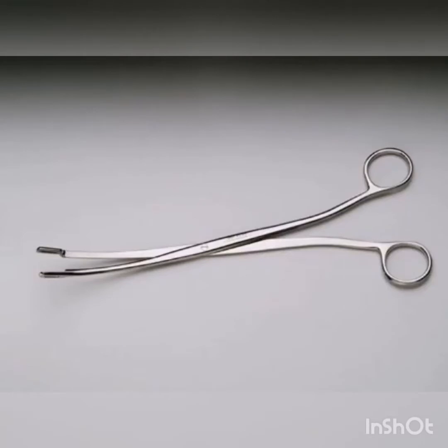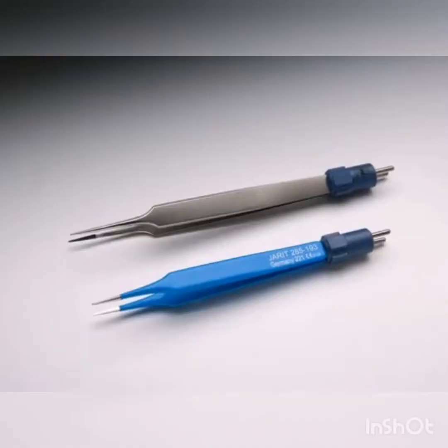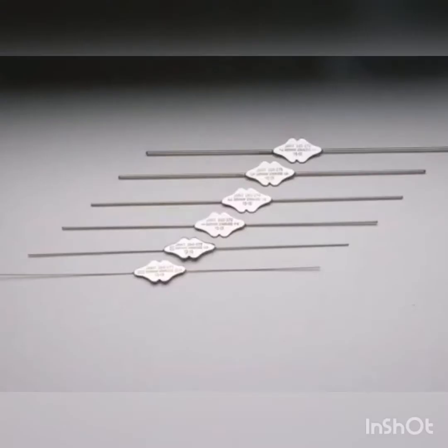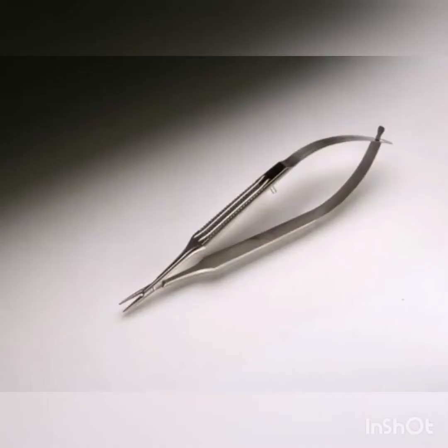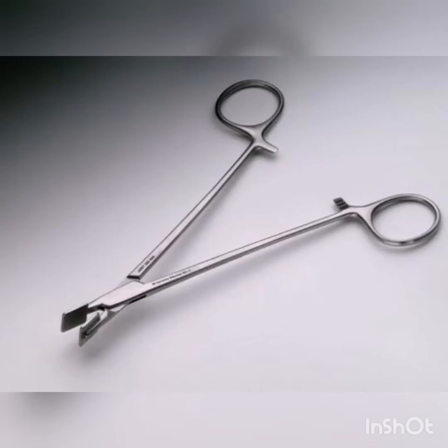Randall Kidney Stone Forceps. Jewelers Bipolar Forceps. Bowman Lacrimal Probes. Castroviejo Needle Holder. House Gelfoam Press.